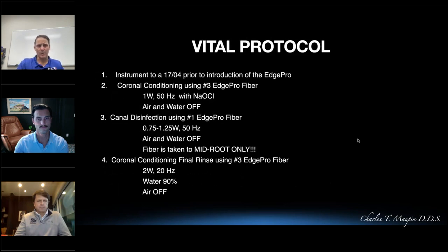This here is my vital protocol. As soon as I access, take a 10 file, see if I can get patency with that, confirm it, instrument to a 17/04 prior to introduction of the EdgePRO. And then I'm going to go through the coronal conditioning using hypochlorite, 1 watt, 50 hertz. Then I'm going to go to the canal disinfection using the #1 EdgePRO. And in between the coronal conditioning and the canals, that's when I'm instrumenting. And then I'll go to the canal disinfection and then a final rinse with the coronal conditioning, 2 watts, 20 hertz, 90% water and air off.